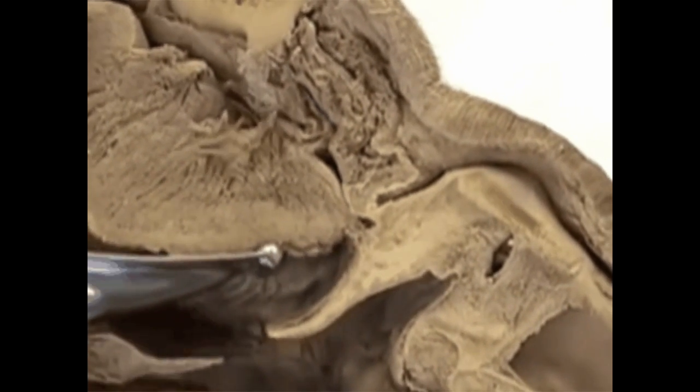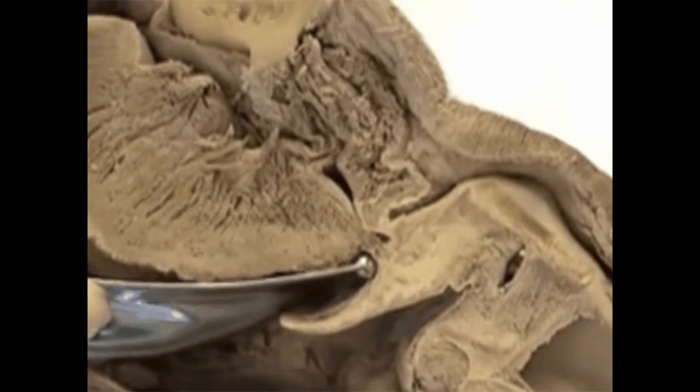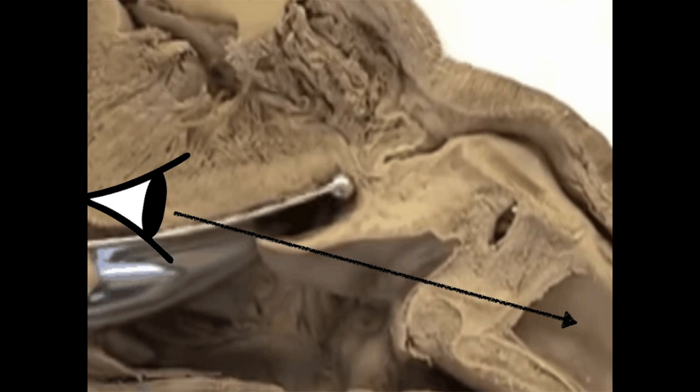Here you can see the laryngoscope working its way down the dorsal part of the tongue into the vallecula. Also notice that the hyoid bone is anterior to the thyroid cartilage. Once in the proper position, the epiglottis can be lifted out of the way, revealing the larynx.